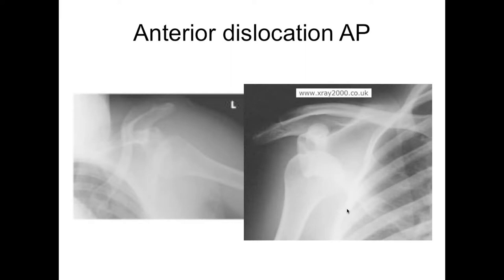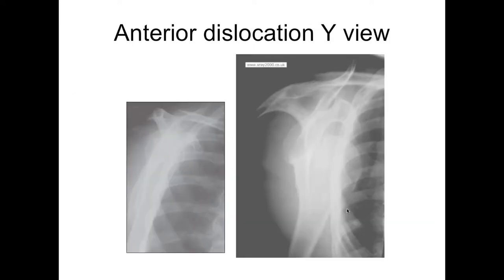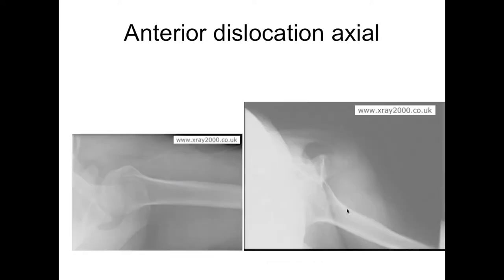Just quickly — on the AP view, the humeral head looks like it's outside the glenoid. The Y view on the left shows it sitting right in the middle of the Y. On the right, it's really going towards the coracoid, which is typical of an anterior dislocation. On the axial view, here's normal — it's sitting inside the glenoid fossa. And here's the glenoid right here, with the humeral head right outside.